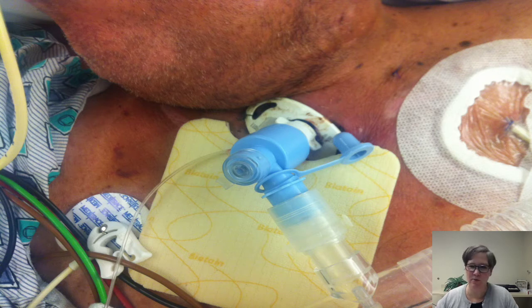So, wow, there is a lot going on here. Lines, tubes. Trach tubes are often the last things we worry about and sometimes considered with the same intent as an IV line. But it is a lifeline for the patient. So did anyone notice that this trach tube is being pulled at a weird angle? Is this important to realize, especially if the patient has increased vent settings? Whose job is it to notice amidst the multitude of different things going on for this patient?